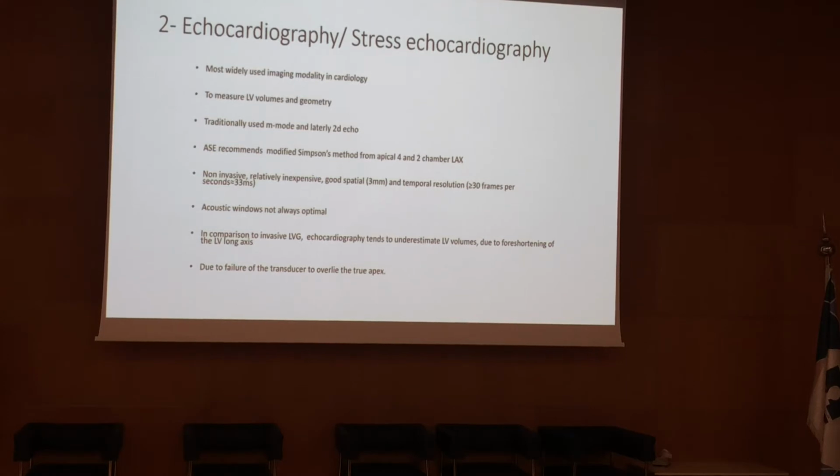It is just a material that goes away without any effect on kidney or other organs. And sometimes we give bubble. We mix saline with air, just 1 ml of air, and inject it in certain situations. So it's a very safe procedure, easy, quick, very available, and very informative, non-invasive test.